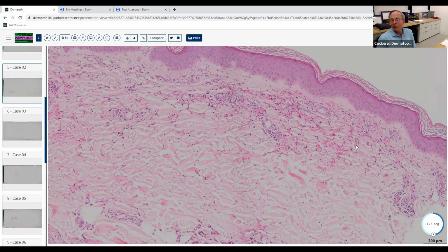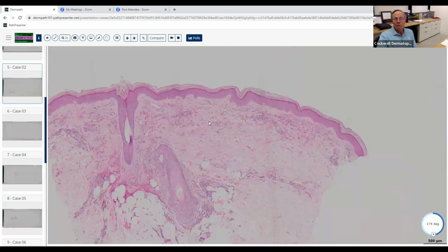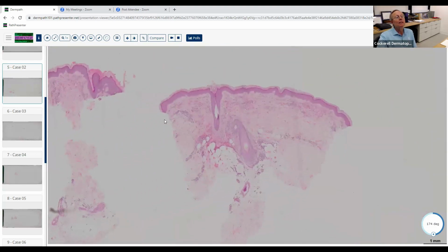We tell them they need to go back to the drawing board and figure it out for themselves, because it could be lupus, it could be a drug eruption, it could be secondary to an infection, it could be due to a lot of things. So vasculitis is really more of a reaction pattern. It's not really necessarily a diagnosis in and of itself. I mean, it is, leukocytoclastic vasculitis, but then it's up to you to figure out why they have it. Do they have HSP? Do they have some underlying connective tissue disease? Something like that. So good. The next time you see this, you'll be able to get the diagnosis at low magnification.